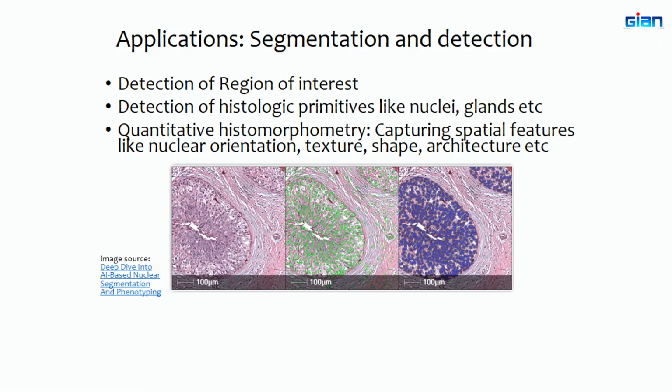But the reason I'm telling you this is because a lot of these features, when pathologists look at them and give you an assessment of the shape and morphology of the different regions of interest or primitives, are subjective. They don't really give a number to that. But imagine if you had simple mathematical filters, or a simple descriptor that can compute how round or how elongated the nuclei is, and you can assign a number to it, that this nuclei is 75% elongated.